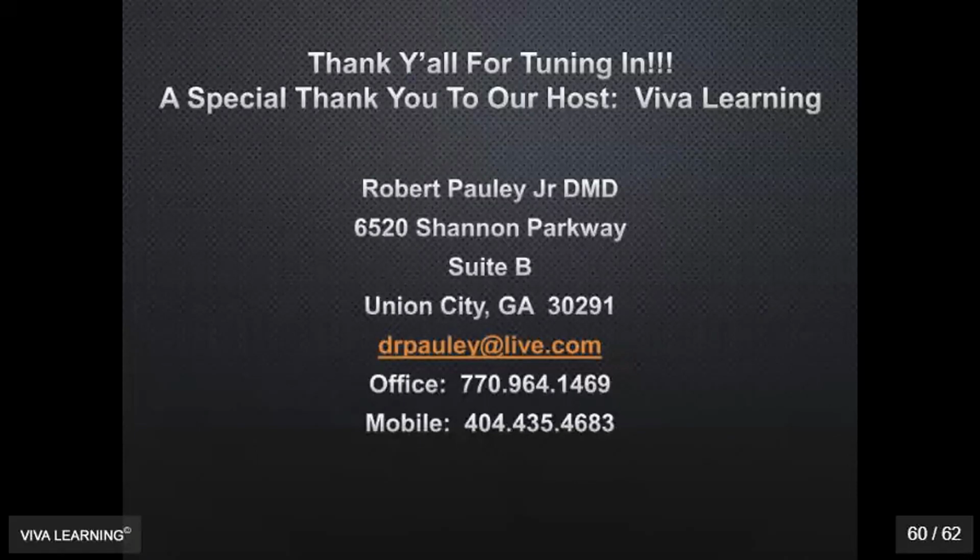What kind of bone graft size mixture is best for socket enhancement, socket preservation? I like that 100 micron mixture. We'll usually do a 50-50 mix if we're using PRF. Sometimes if we don't use PRF, we'll use a little more demineralized. For this, I would point you in the direction of Salvin Dental, who I utilize a lot for the biologics.